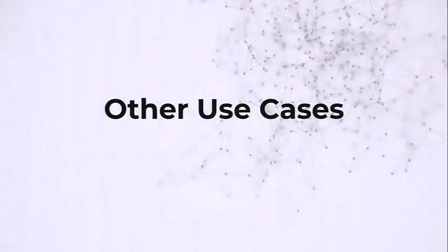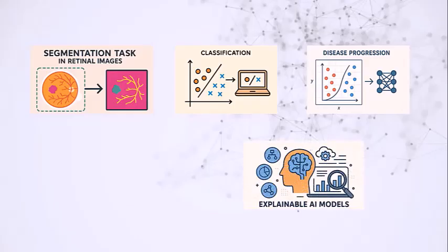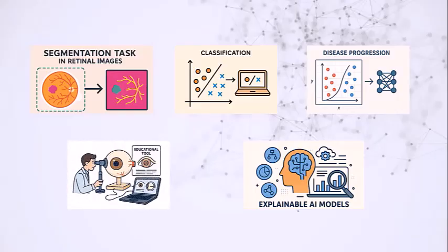MAPLES DR dataset isn't just for performing segmentations. It can be used for classification tasks, to study disease progression, to develop explainable AI models for diabetic retinopathy screening, as an educational tool for ophthalmology training and much more.